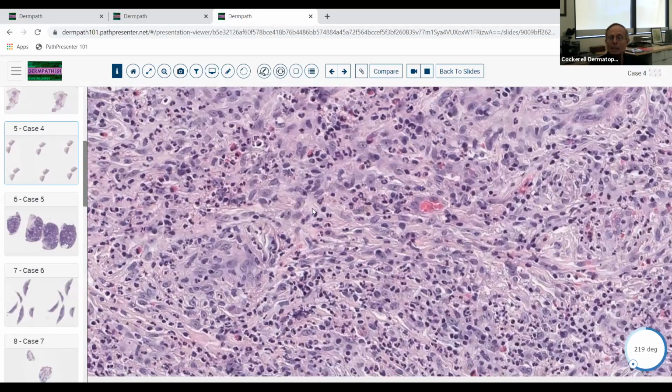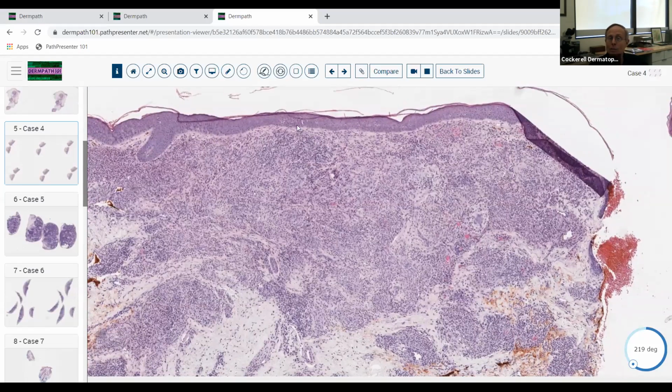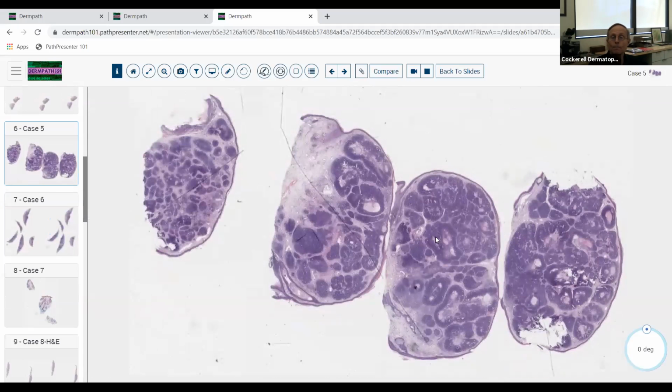So if you see something clinically that's brown, it doesn't have any scale, there's a Grenz zone here, the epidermis is not involved, you get these patulous ostia, think clinically of granuloma faciale. It's not really granulomatous. It was actually named that because years ago it clinically looked like a granuloma. So that's something to remember there too. It's not really a granulomatous dermatitis.